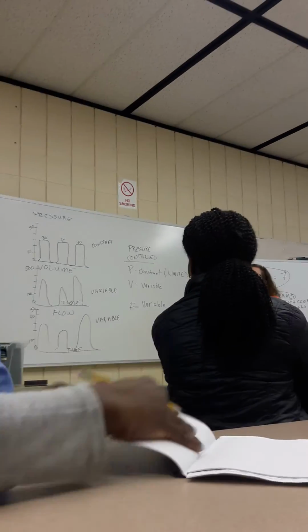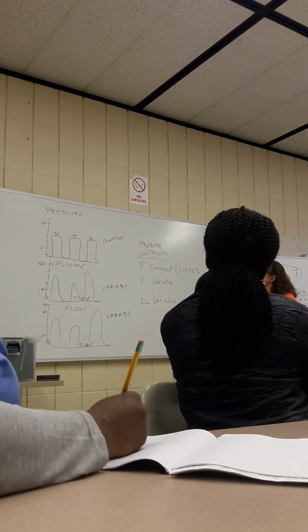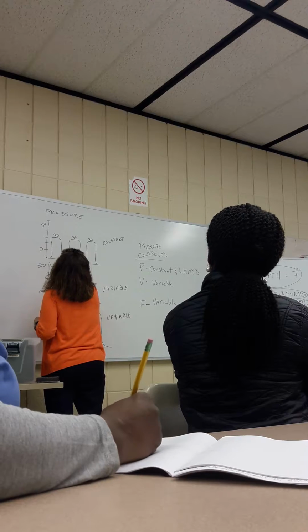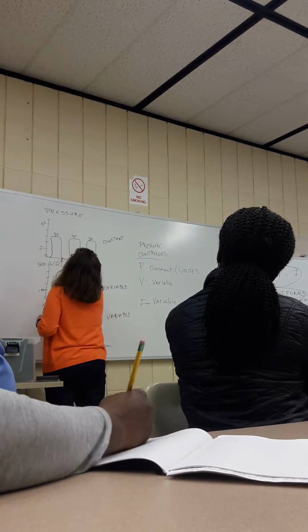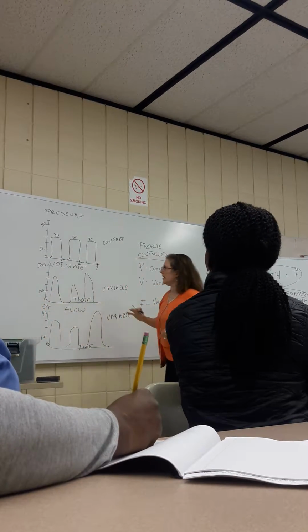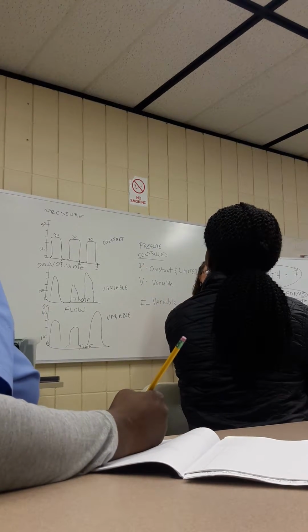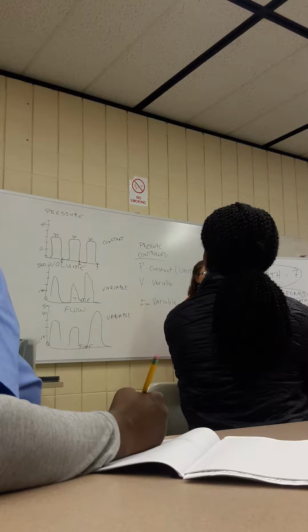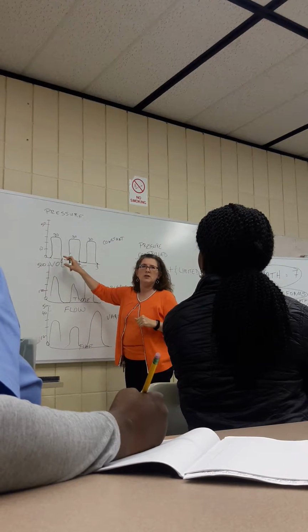Can I determine if I have time in here, 1 second, just hypothetically? Could I determine looking at this graph what my eye time is, provided that they were equal? Yeah, because I could look at the distance from each time.